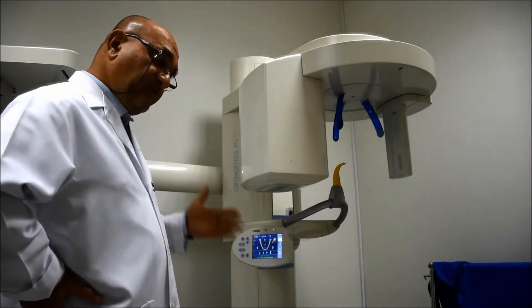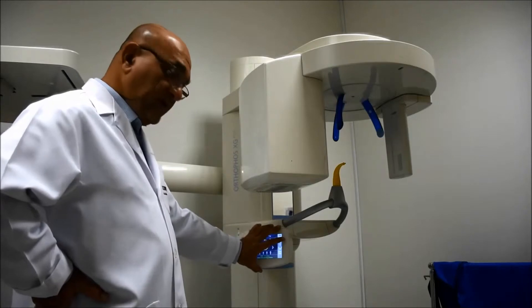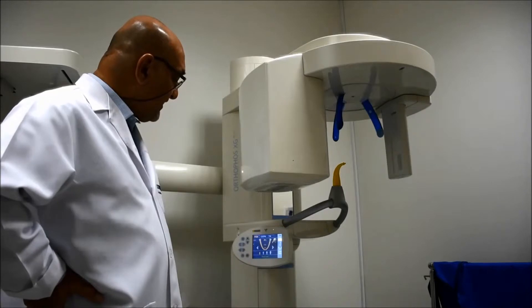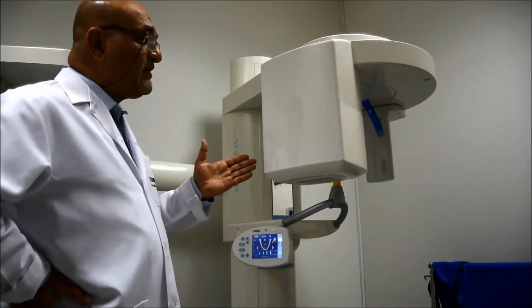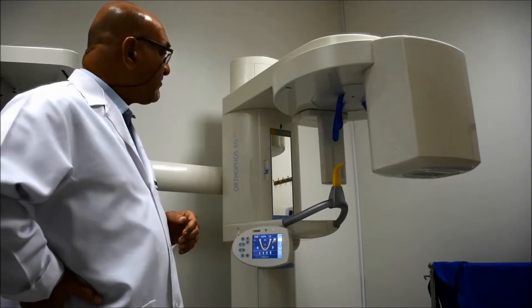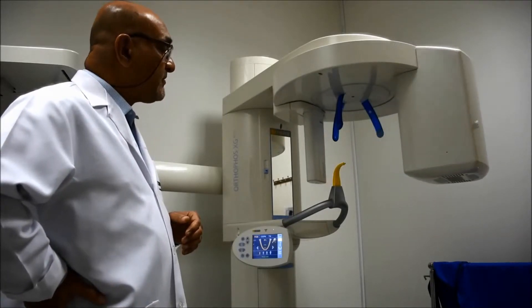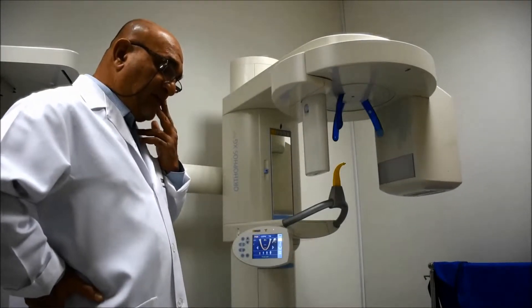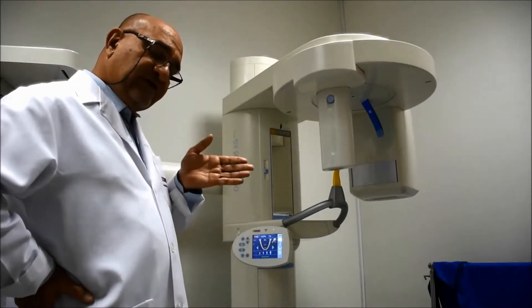After the first click of resetting the screen or the touchpad of the machine, we are going to click reset again. This will bring the machine into its zero position, which is where the exposure is going to start. This is a good thing if the patient is standing with you, so they can see what is happening.